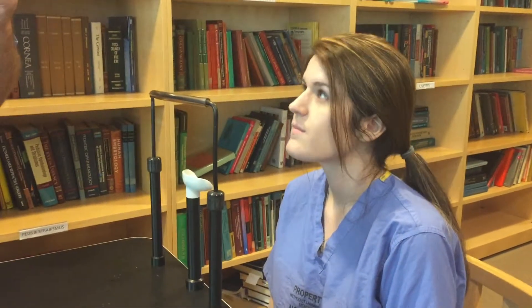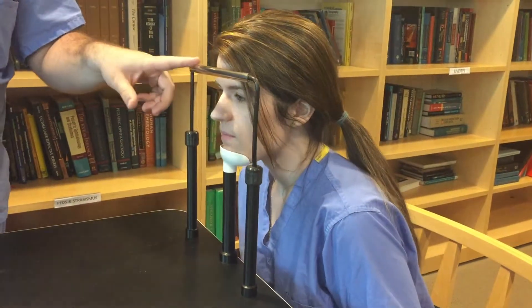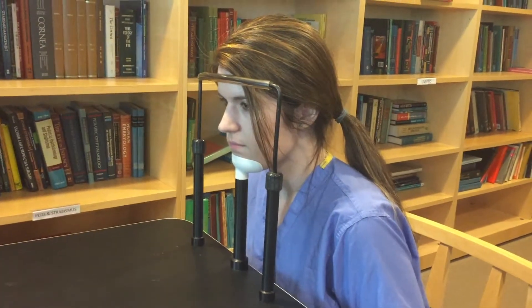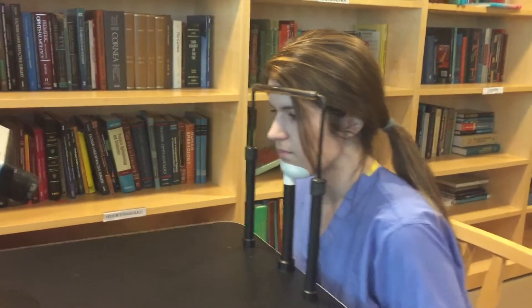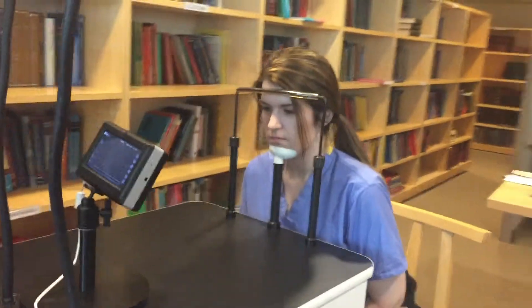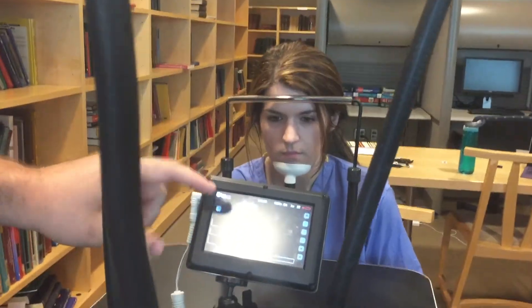We have our lovely model here. Anytime you're going to video a patient, it's important that they put their chin in the chin rest and make sure that their forehead is touching, because the camera has a very narrow depth of focus. Next, take your lights, make sure they're on — you'll notice that the camera is very dim.